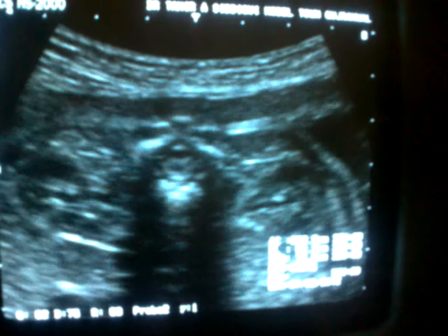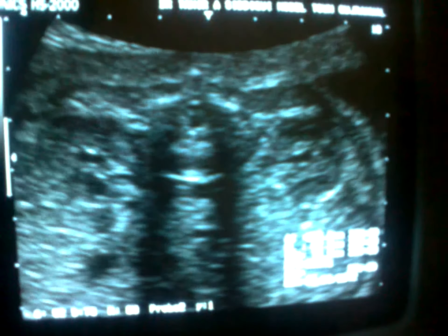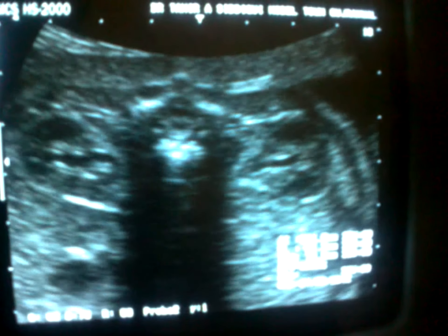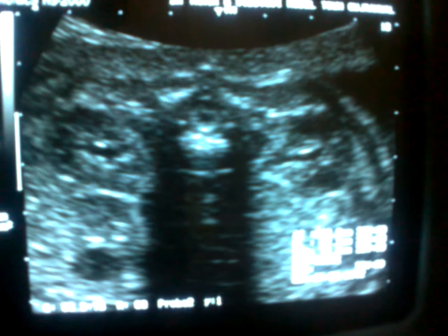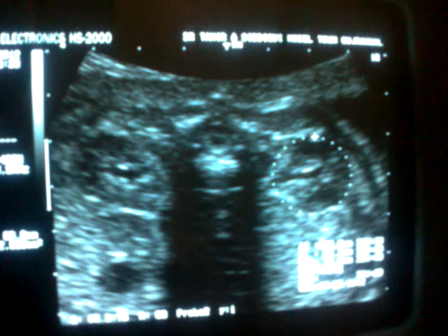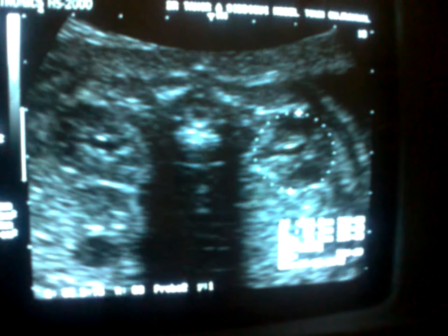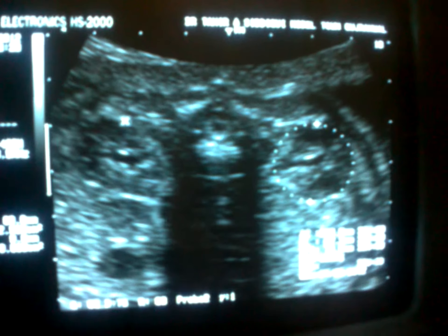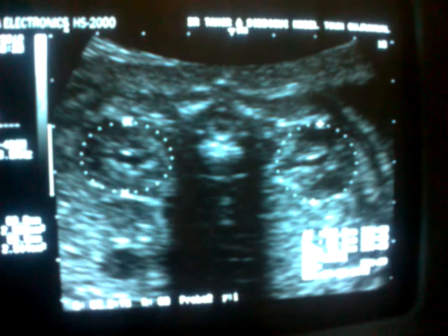This is magnified so you will be able to see it in a better way. Here you can see both kidneys together — this is one kidney, and this is the other kidney. Both kidneys are visible in the lumbar region.